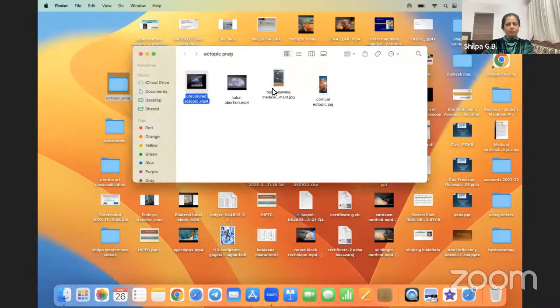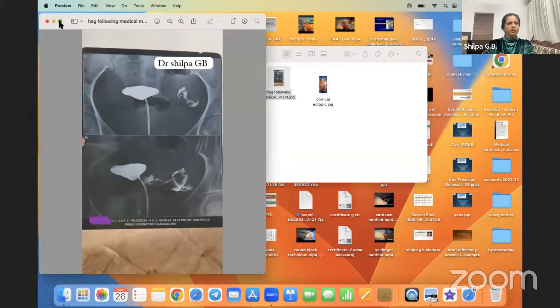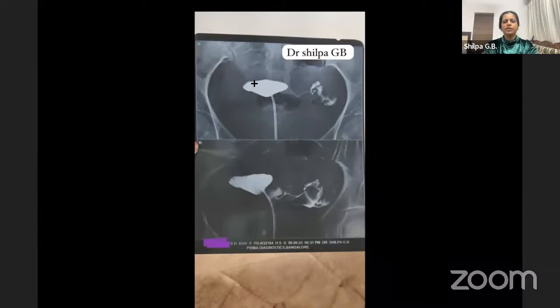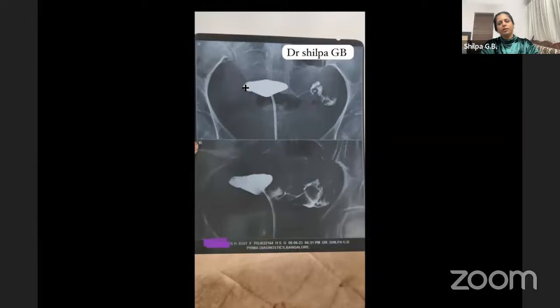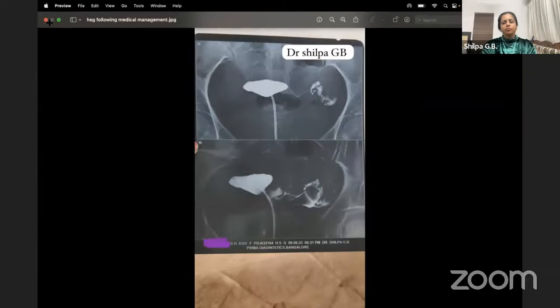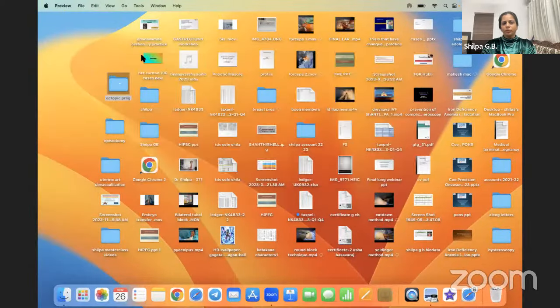Here is an HSG done for a patient after six months because they did not conceive. This is a right ectopic that was managed, and you can see there is a right cornual block. Usually if there is a block it won't necessarily be a cornual block but we cannot ignore it. When we have done medical management especially with multiple doses of methotrexate and the pregnancy size is not really resolving in spite of beta hCG being low, those are the times when we see a blockage in the fallopian tube after medical management.